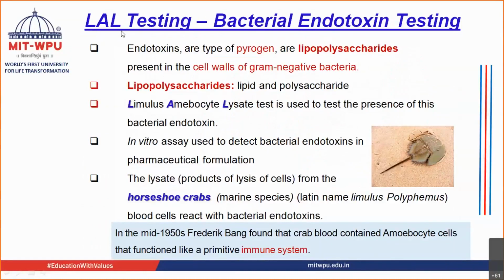Now coming to LAL testing. What is LAL testing? The word LAL has been derived from Limulus amebocyte lysate test. This is the full form. It is another name for bacterial endotoxin testing. This is nothing but an in vitro test.